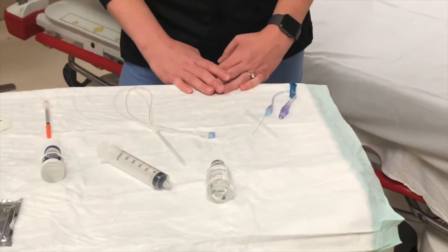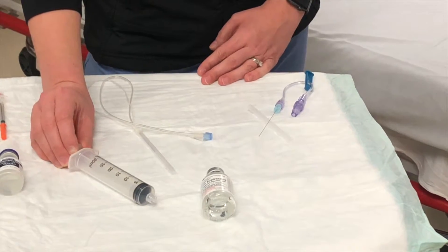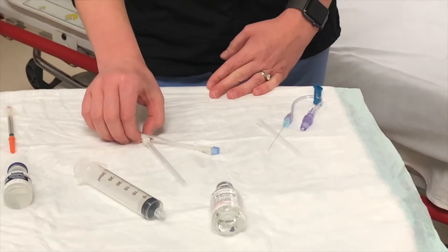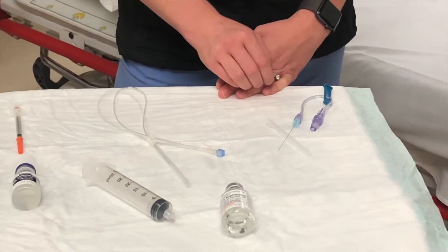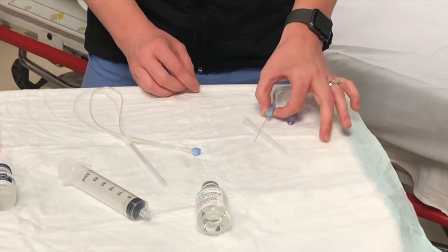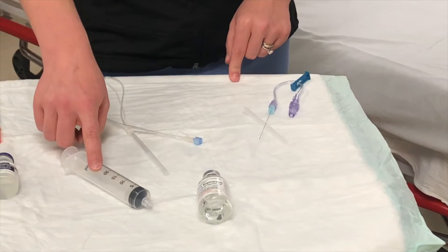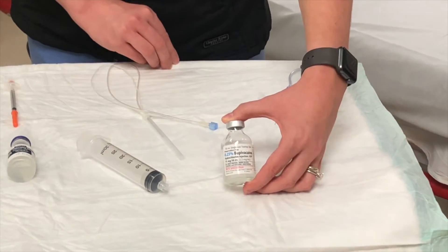Lastly, you'll need the supplies for the nerve block itself. We use a 30cc syringe hooked up to one of two setups. If you're lucky enough to have an ultrasound-guided nerve block catheter, grab one of those. If not, you can hook up a 22 gauge spinal needle connected to some IV tubing which can connect to the syringe. At our institution, we use 0.25% bupivacaine for the block itself.